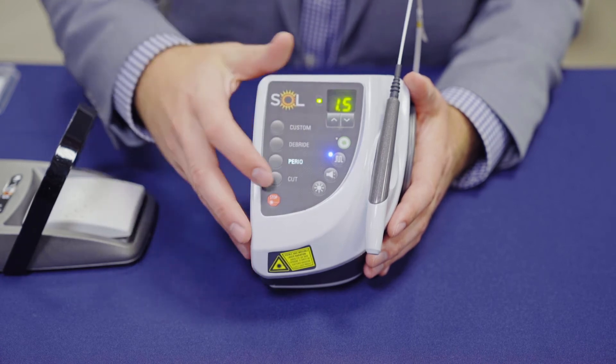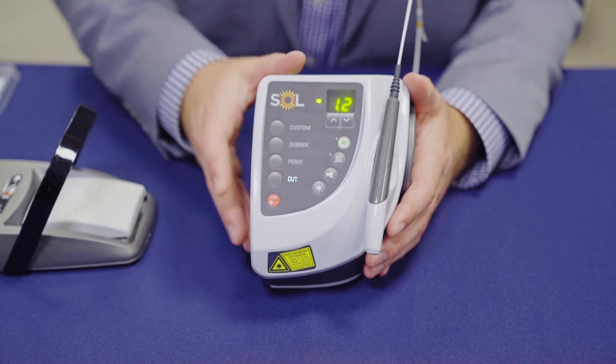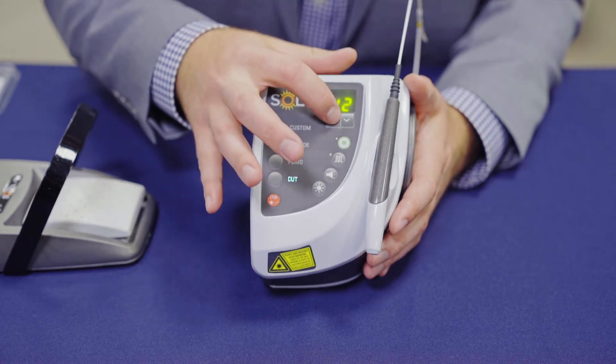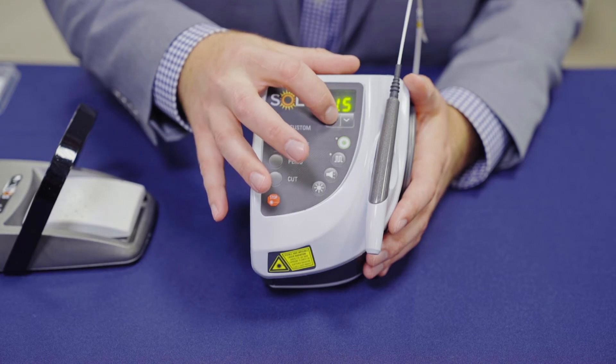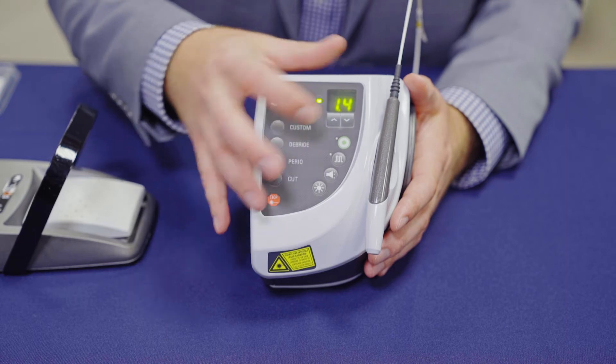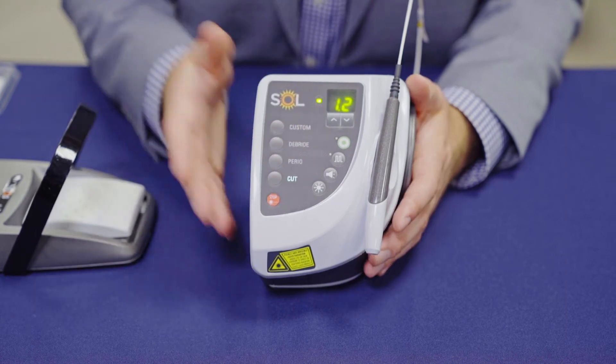You can change your wattage here for the perio setting. Finally, the cutting mode, preset to 1.2 watts. You can adjust it if certain tissue needs to be ablated at a higher speed, or you can leave it on the standard setting.